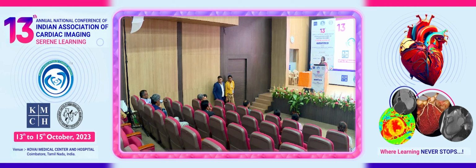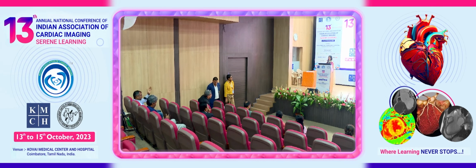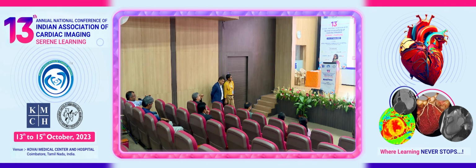Hemant, just one comment. For the knowledge of everyone, there are newer software packages, one of them called QFR, which is basically equivalent to CT-FFR, but in the cath lab. You just do a diagnostic catheter angiography, and it gives you the FFR of every vessel at every level, without having to go in and put a guide wire. That is also very, very effective as of now. Thank you.